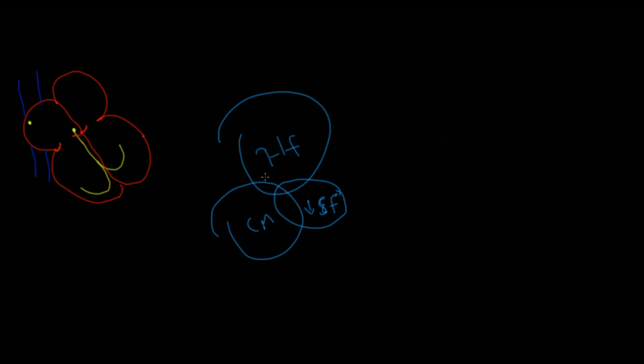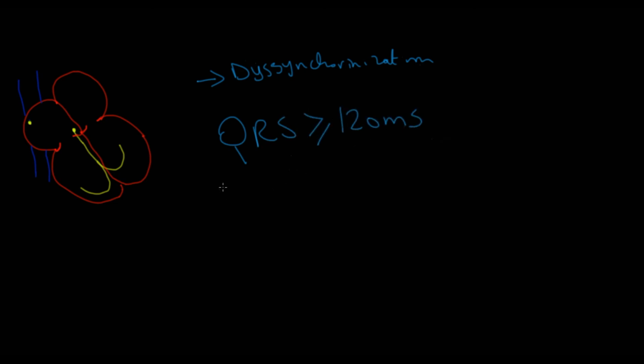Now, moving forward, what is the pacemaker used for in the cases of heart failure? We mentioned when there's dyssynchronization between both ventricles in the event of bundle branch block. So the basic criteria, which is not entirely accurate at the moment, that I want you to remember for using the biventricular pacemaker, is QRS duration equal or more than 120 milliseconds and ejection fraction less than 35.